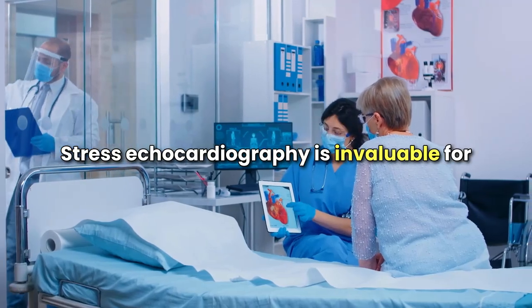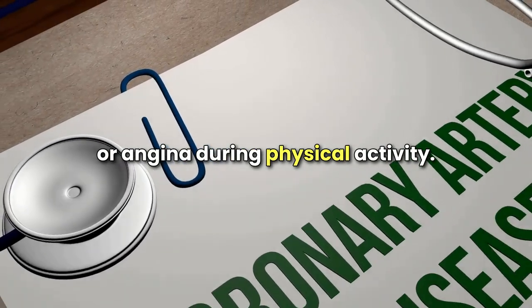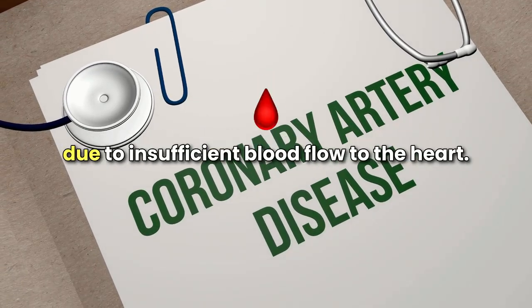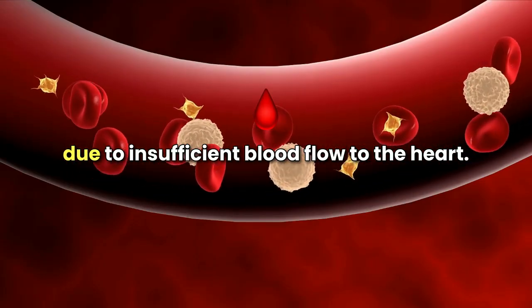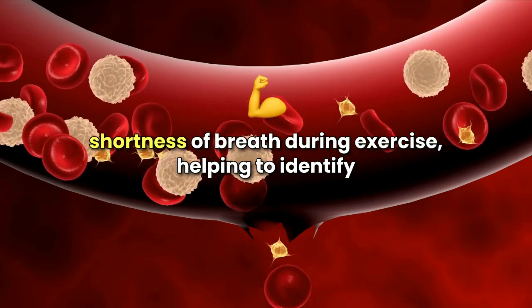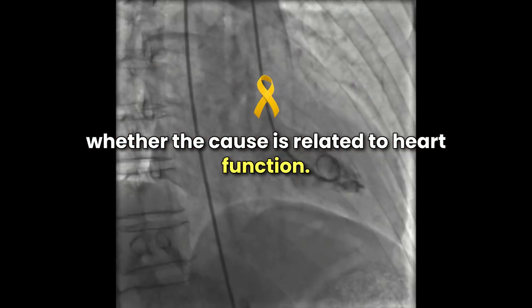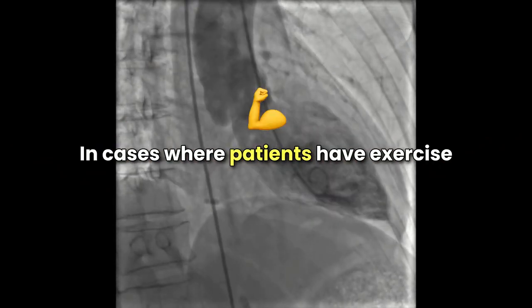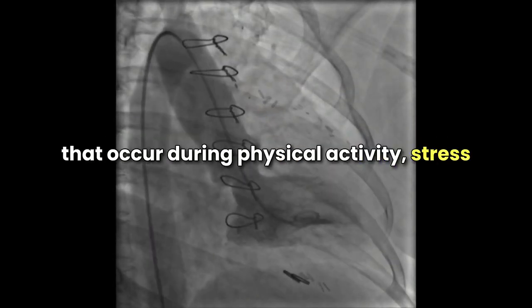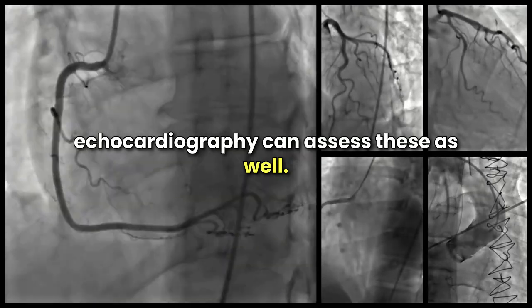Stress echocardiography is invaluable for patients who experience chest pain or angina during physical activity. The test helps determine whether this pain is due to insufficient blood flow to the heart. It's also useful for patients who experience unexplained shortness of breath during exercise, helping to identify whether the cause is related to heart function. In cases where patients have exercise-induced arrhythmias or abnormal heart rhythms that occur during physical activity, stress echocardiography can assess these as well.